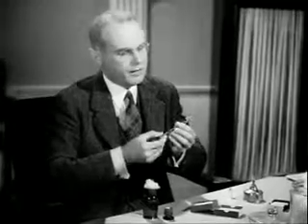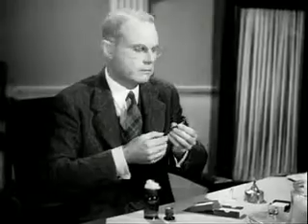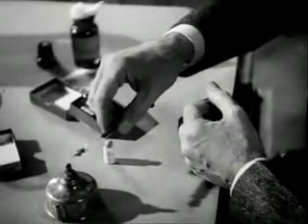Use a 1 cubic centimeter tuberculin syringe that has been sterilized. Inspect the needle for sharpness. Flame it to make sure that it is sterile.